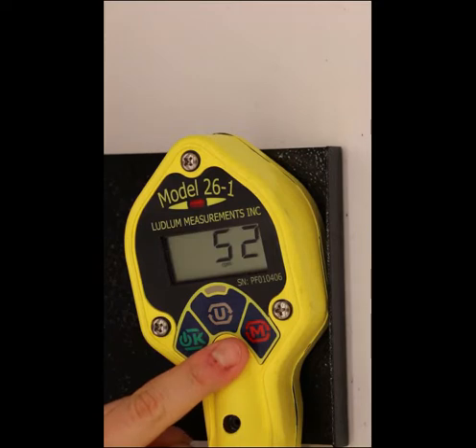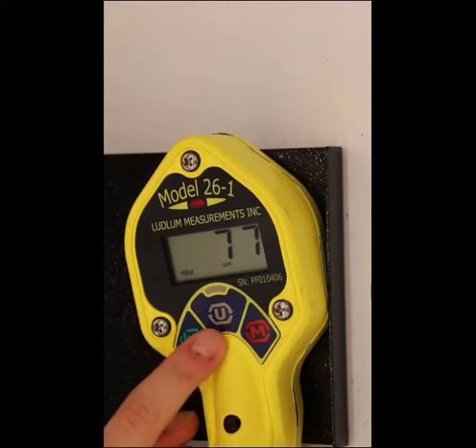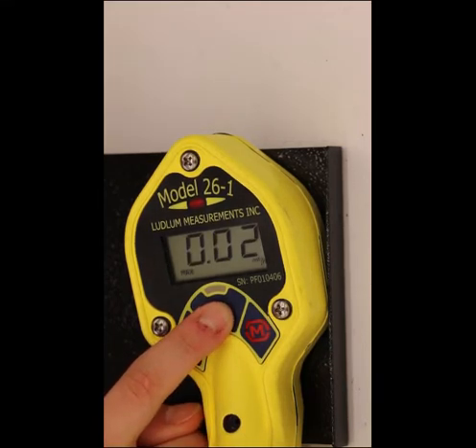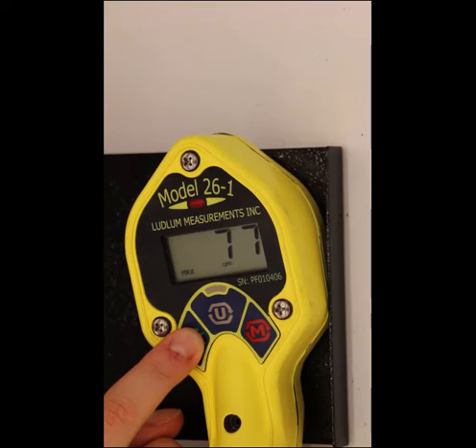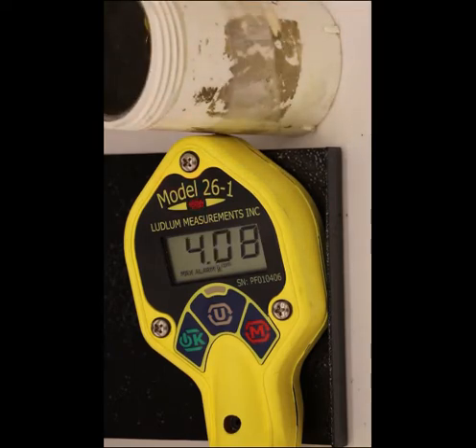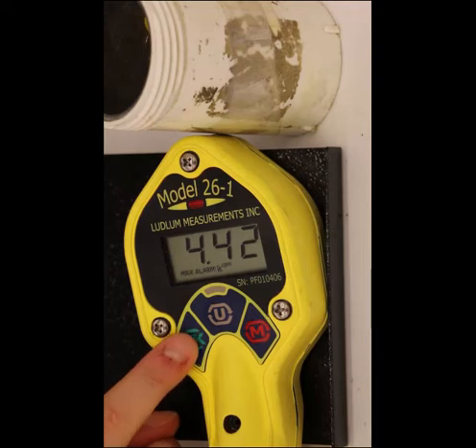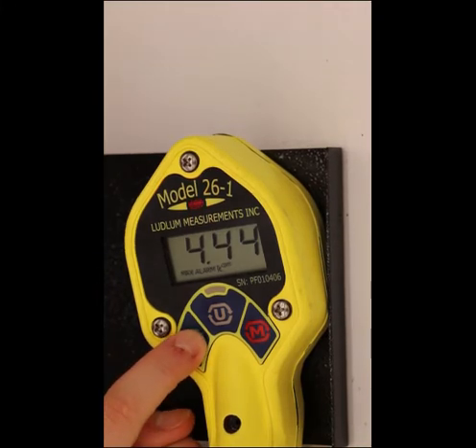Pressing the mode button will change to the max mode. The word MAX will be displayed, and while in max mode, the highest detected count rate since the last reset is shown. Pressing the units button switches between primary and secondary units. A press of the OK button will silence the click audio; pressing it a second time will reset the display and re-enable the click audio. If an alarm condition is present, pressing the OK button will silence the audio, and pressing it again will reset the alarm and re-enable the audio.